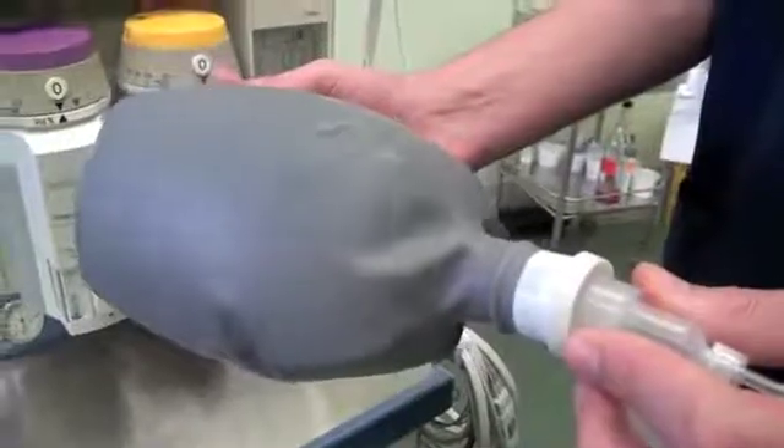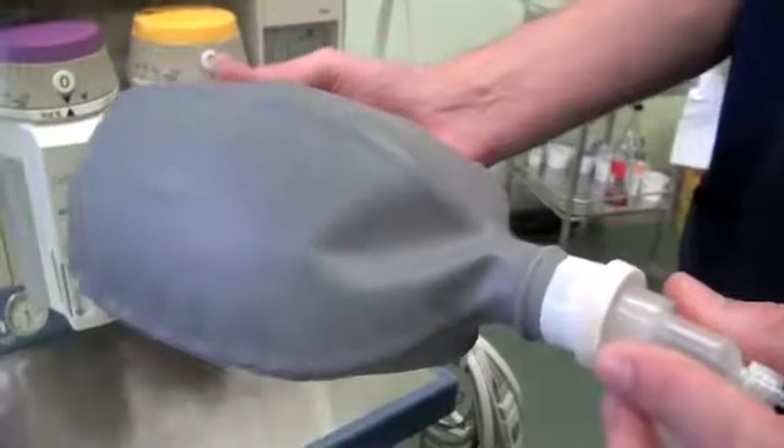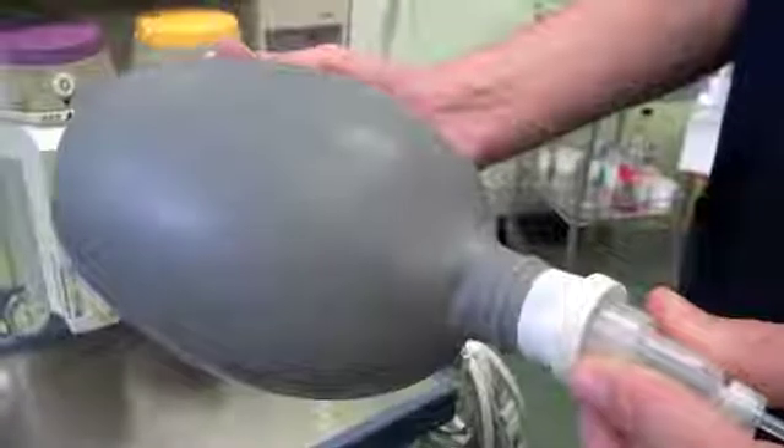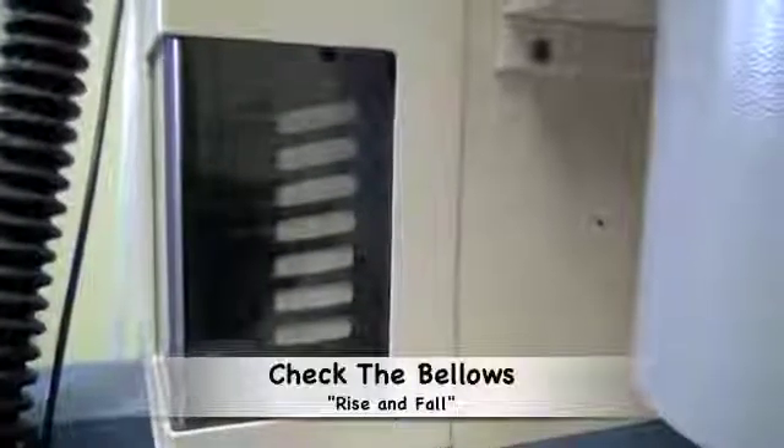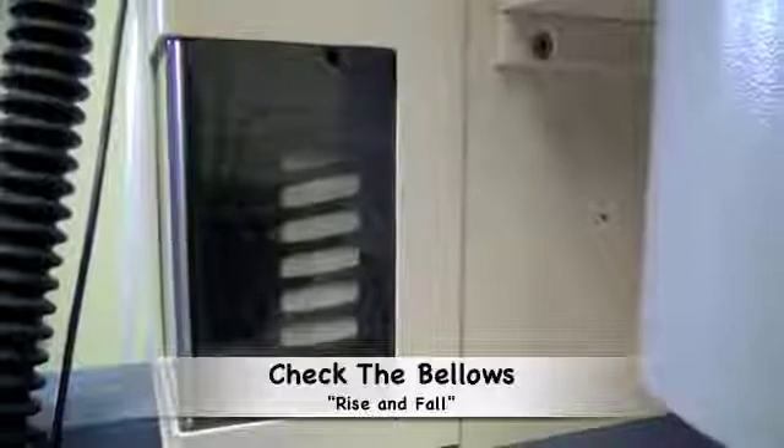If the ventilator continues to work and the bag continues to inflate and deflate, this means there are no leaks and the system is working. One needs to watch and assess the movement of the bellows to ensure that the bag is seated correctly and also to ensure that there are no leaks.